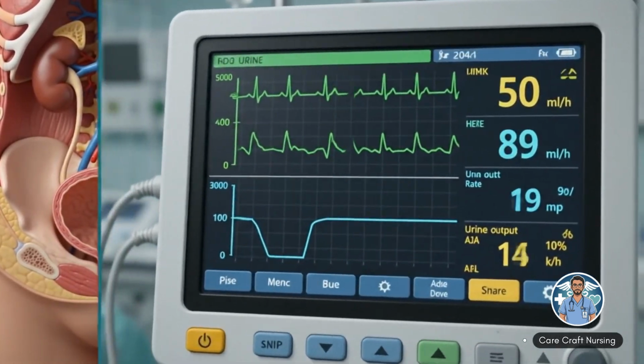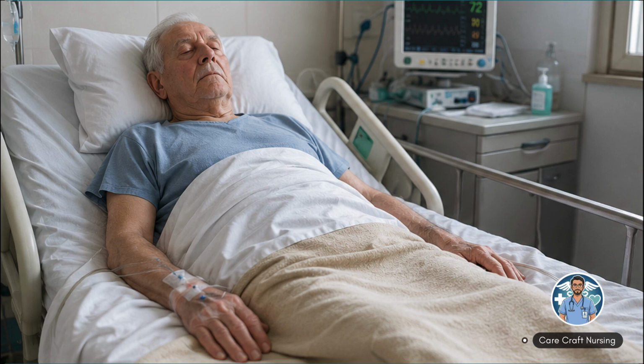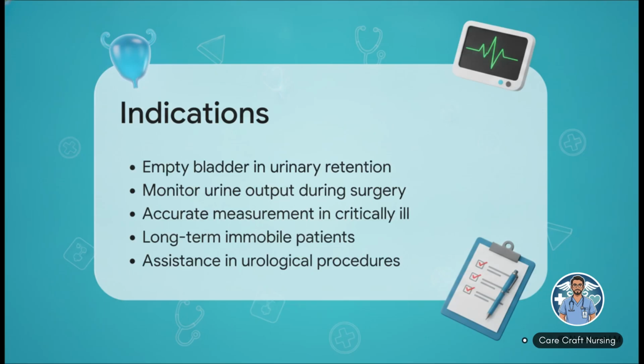It's also super vital for getting accurate urine measurements in critically ill patients, managing folks who are immobilized long-term, and supporting patients with a neurogenic bladder, where nerve damage disrupts natural control. Oh, and it's essential for providing assistance during specific urological procedures. So yeah, it's a very versatile tool with massive clinical importance.